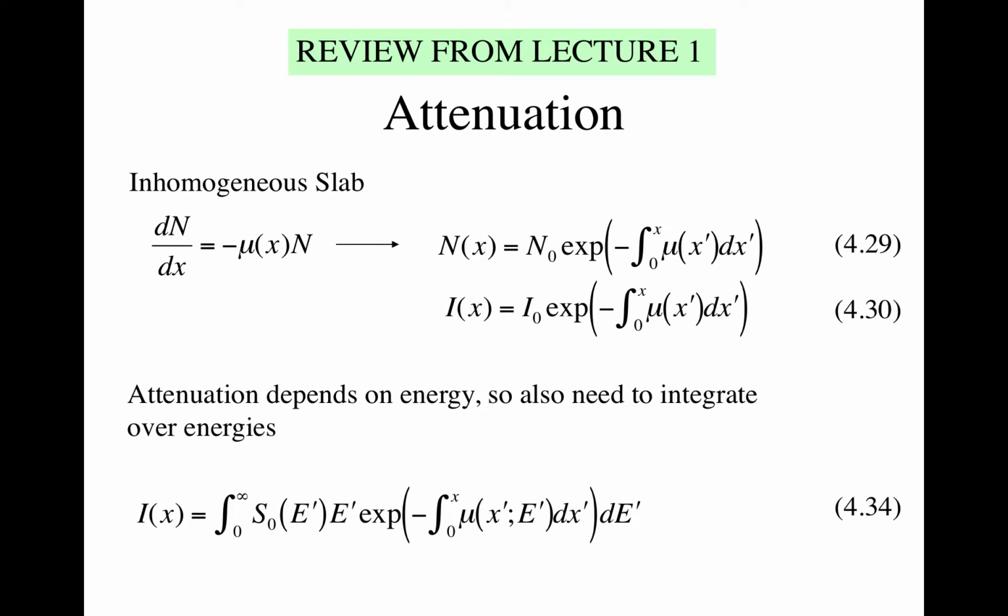So the interesting thing happens when you have an inhomogeneous slab of material, right? Now a person isn't a bag of water or 1 millimeter of copper, right? They're this conglomeration of stuff. If I draw a line through any beam through a person, I'm going to get different mu values as I go through.